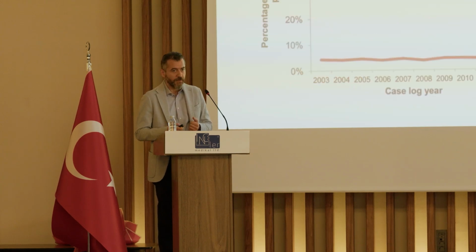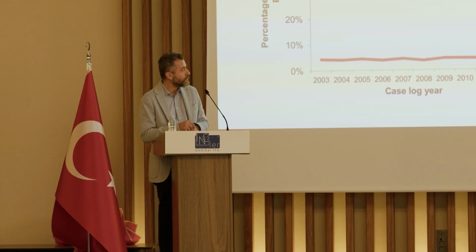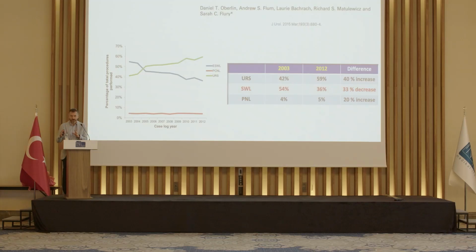And this is another study coming from North America, about 10 years of follow-up for the main practice in North America, and we can see that the rate of use of the shockwave lithotripsy has decreased by 33%, and for ureteroscopy, there is a 40% increase, and for PCNL, it's mainly stable, from 4% to 5%. The reason is PCNL is for the bigger stones, so you don't have any other option than PCNL for those very big stones, but URS and shockwave can be used interchangeably, and in the recent years, the shockwave is actually losing a lot of ground, and we are practicing more and more with flexible ureteroscopy.